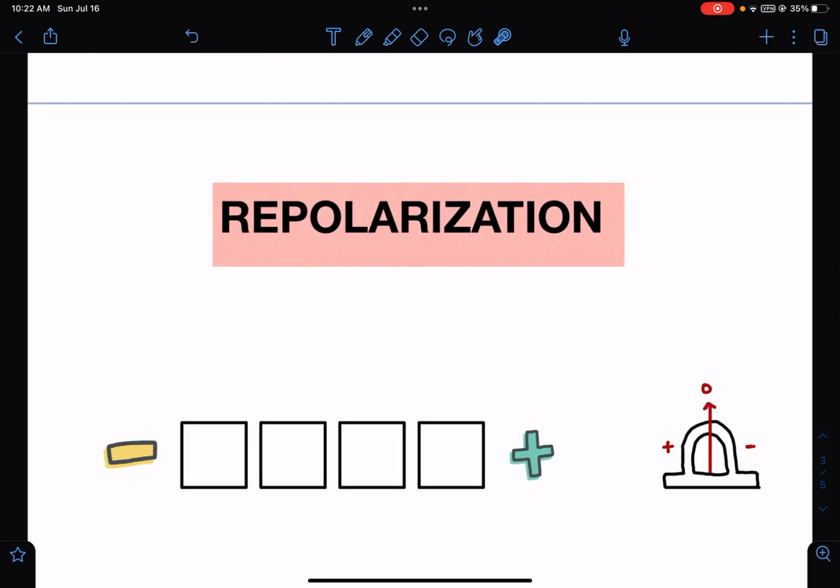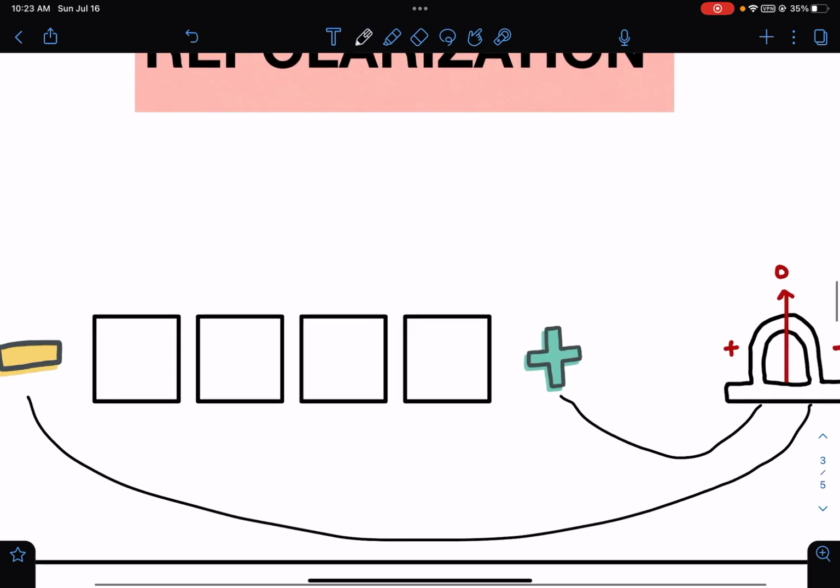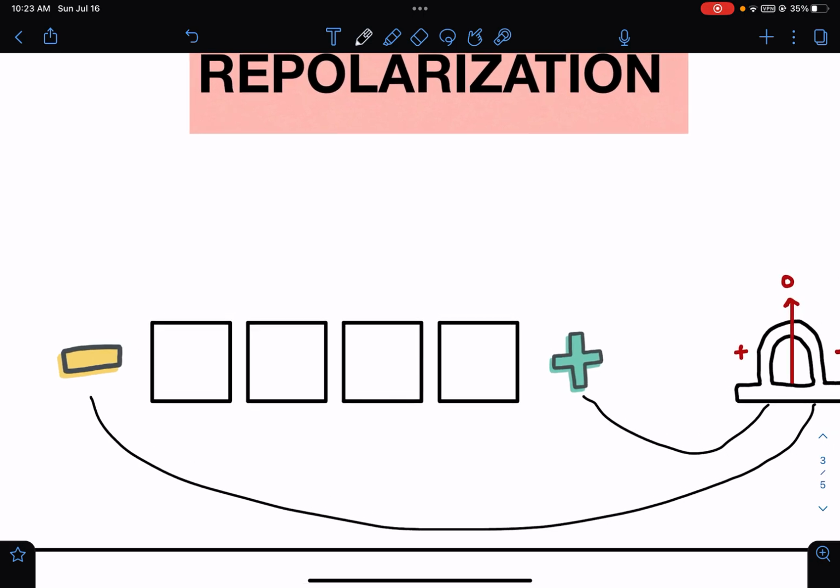As we know that after depolarization, after cardiac muscle contraction, there will be relaxation, right? In other words, it's called repolarization. Okay, so let's see, also we connect this pole to the galvanometer. In case of repolarization, positive charges move out of the source and it would go down to minus millivolt, the resting membrane potential. Okay, so there will be a lot of negative charges here, right? So move like that, 1, 2 and then 3 and reach the negative pole.